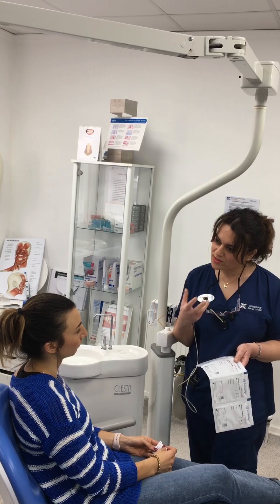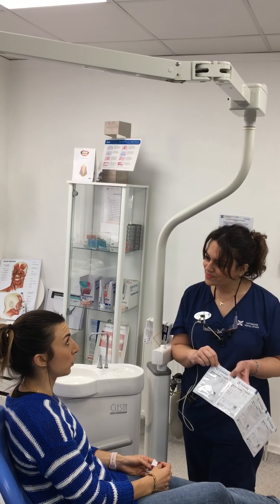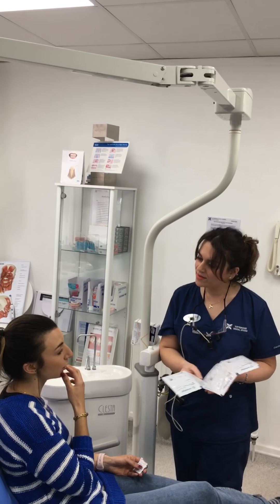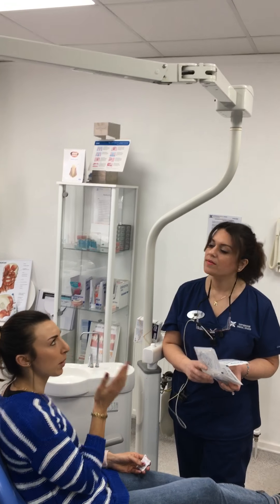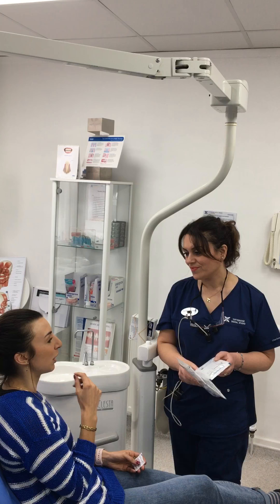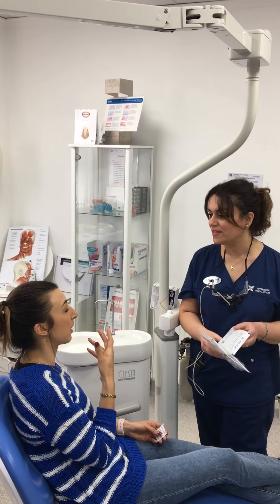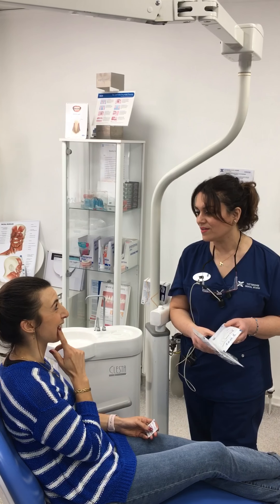Do you remember what can get affected? Certain foods can discolour the aligners, and smoking — don't smoke. Just make sure you look after them, and don't eat crunchy things, just in case.